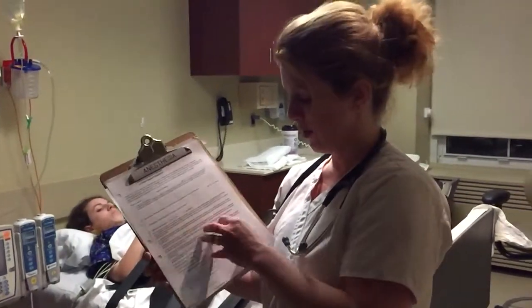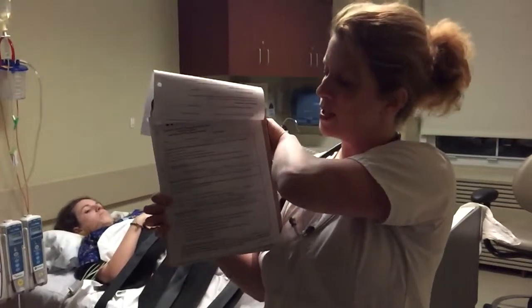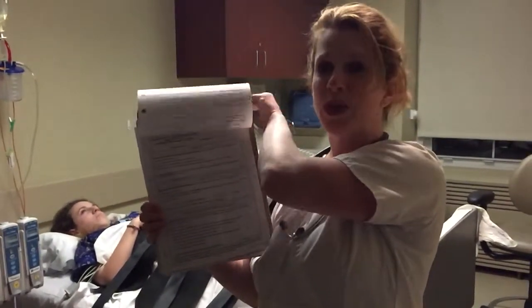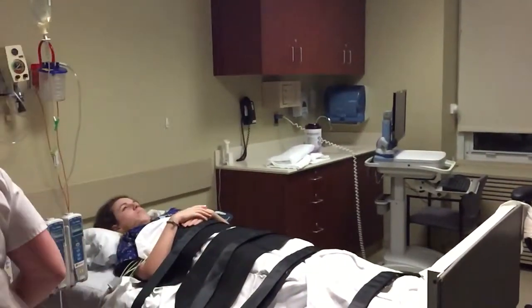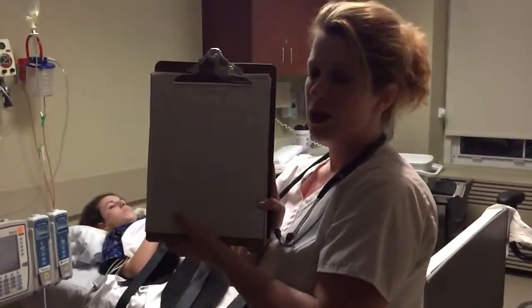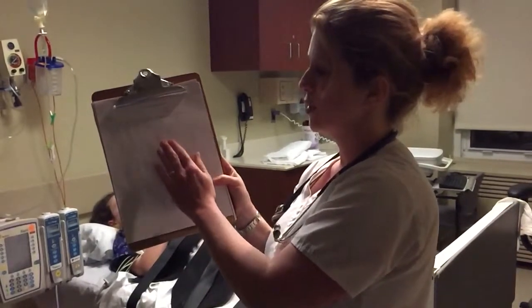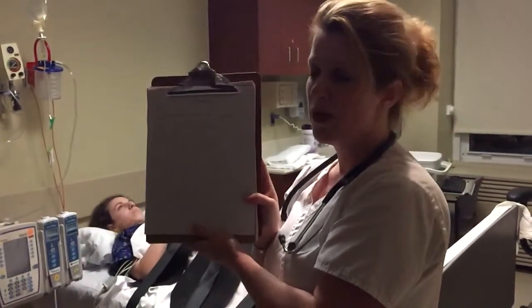The next form that we fill out is called a timeout form, and it's a 3-step process that we use here to make sure that everybody is on board: same time, same procedure, right patient. We also use this flow sheet during the procedure of the tilt table, and it will monitor their blood pressure, pulse, oxygen saturations, and any signs and symptoms they might be feeling.